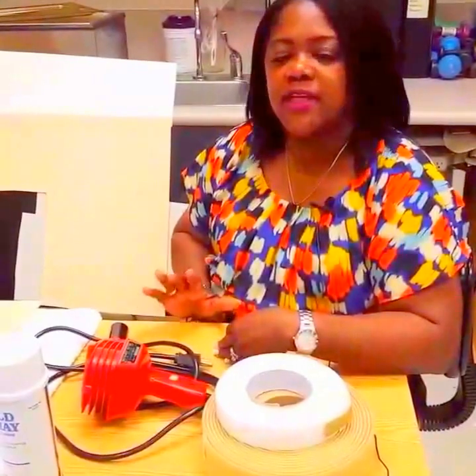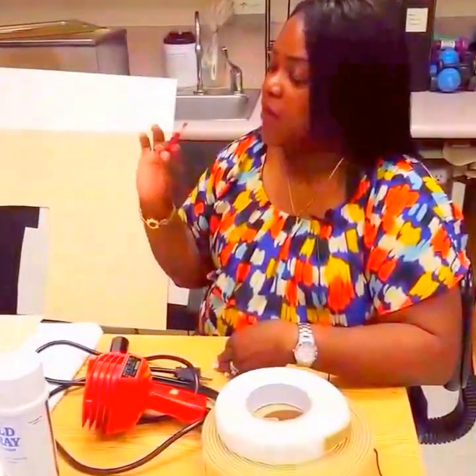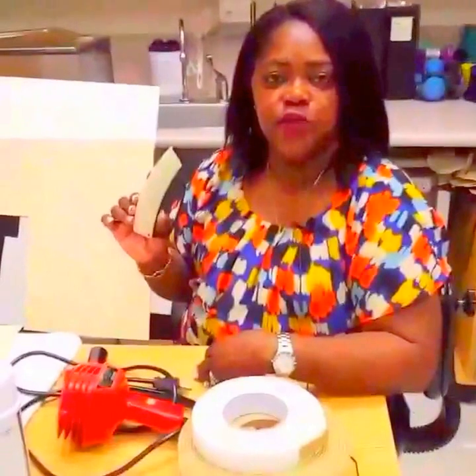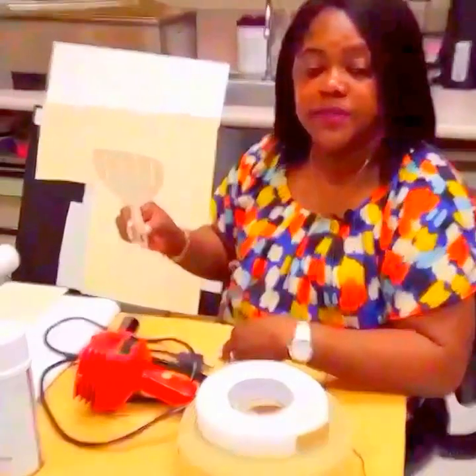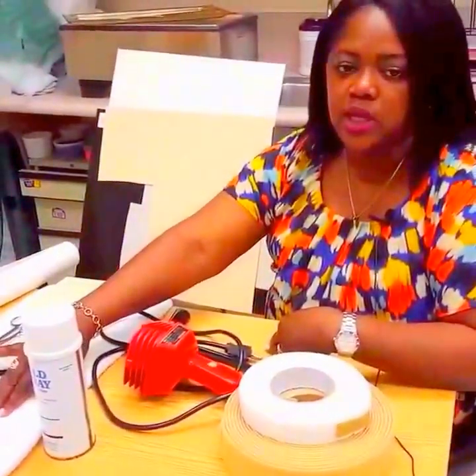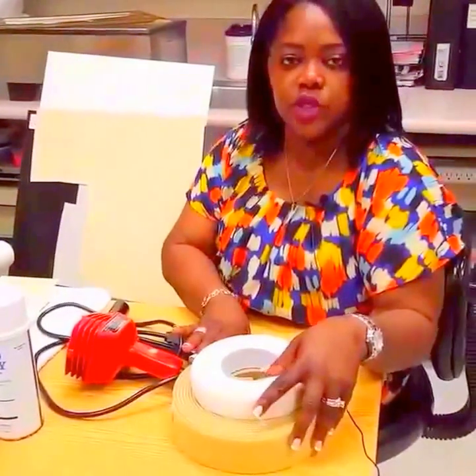Before we get started on making the pattern and the splint, we are going to need a few materials and supplies. First, you're going to need paper for your pattern, a crayon for outlining your pattern as well as for transferring the pattern onto your splint material, a utility knife for scoring the splint material initially to allow easy cutting, scissors for cutting your pattern as well as cutting your splint, a spatula to transfer your splint material from the splint pan as the water is very hot, a towel to remove excess water from your splint material before applying it to your patient, and strapping — hook and loop — to secure the splint to the extremity.